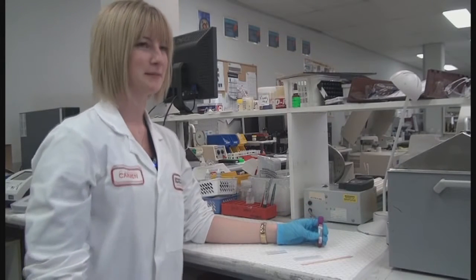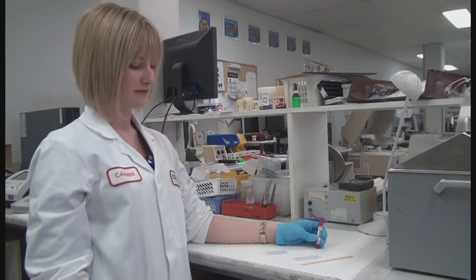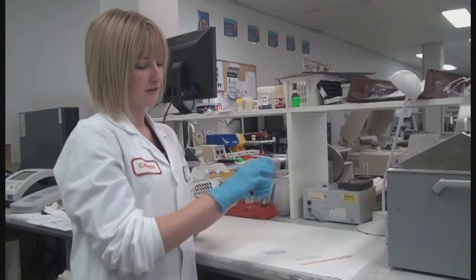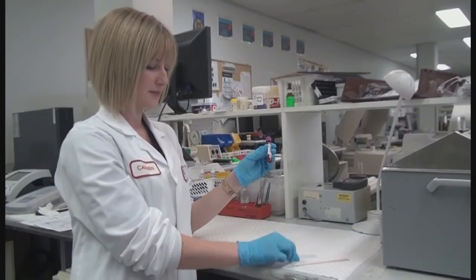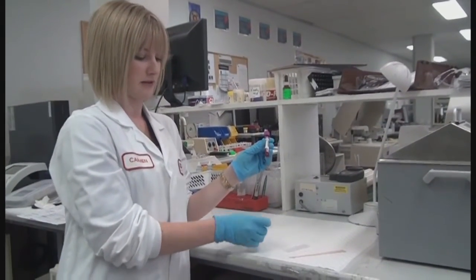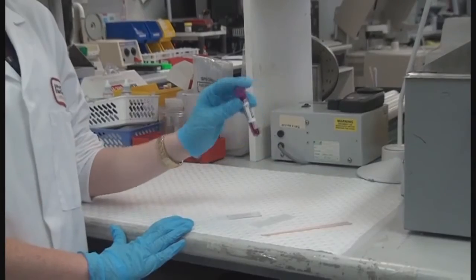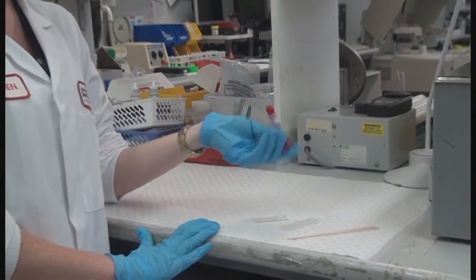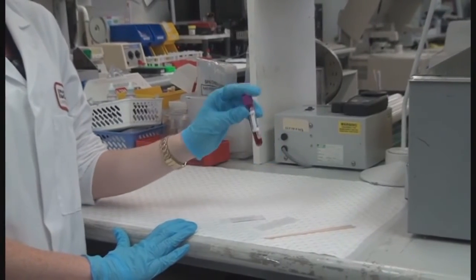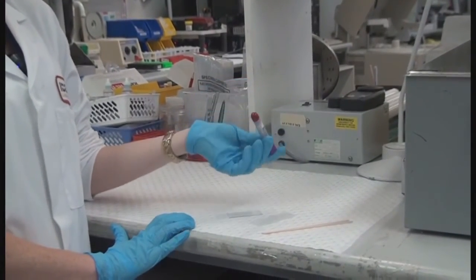Today I'm going to show you the basic process of making a blood film in the laboratory. I've got my EDTA tube here, 2 wooden applicator sticks, a spreader and the blood slide. So I'm going to start by making the blood nice and homogeneous by inversion, about 5 times, not too fast, you don't want to make any bubbles.